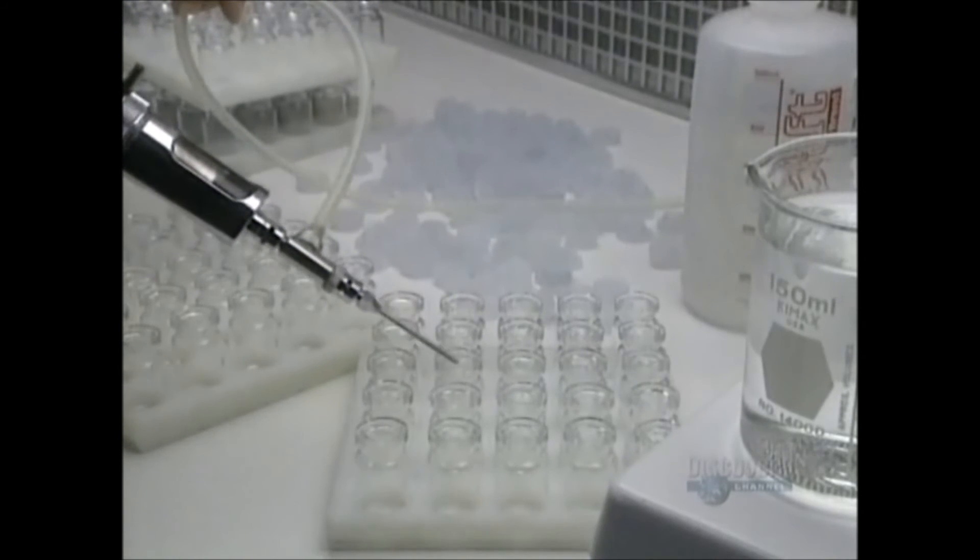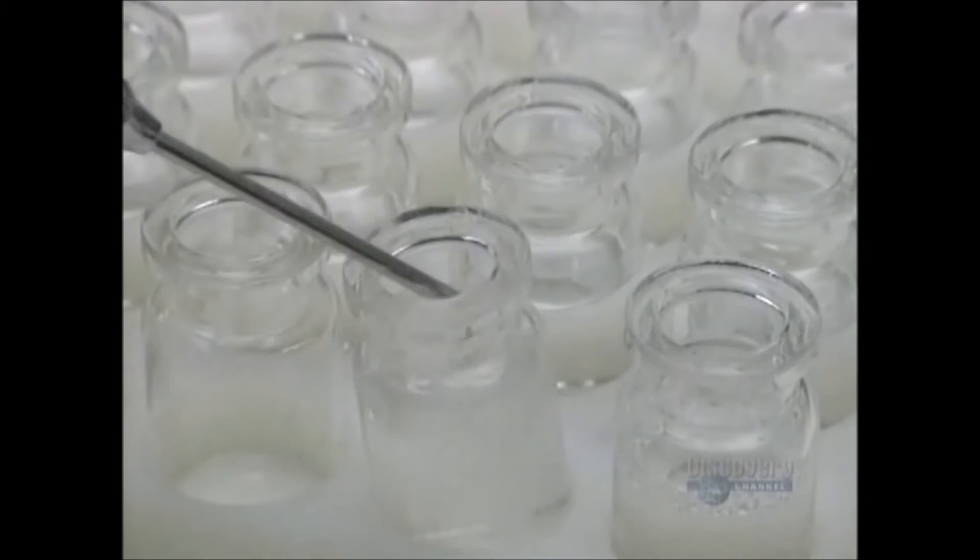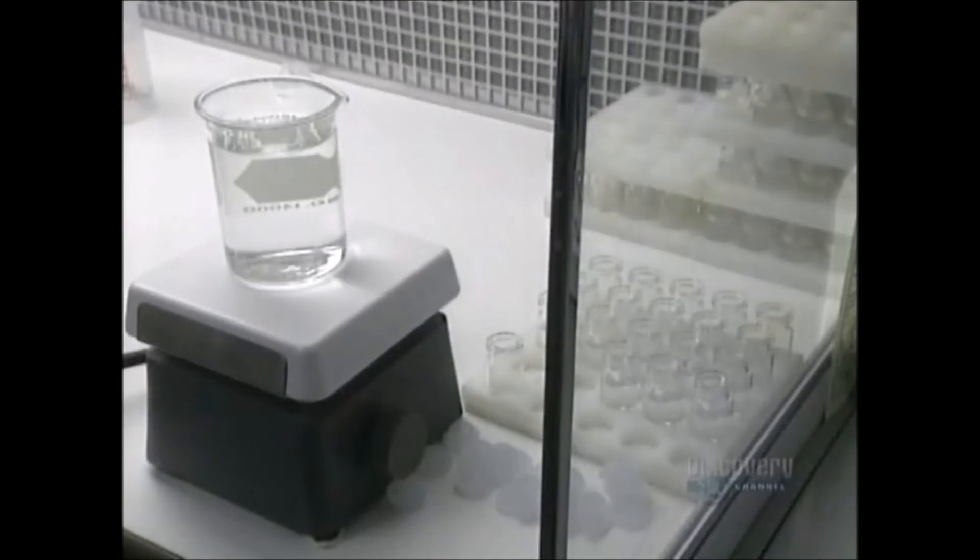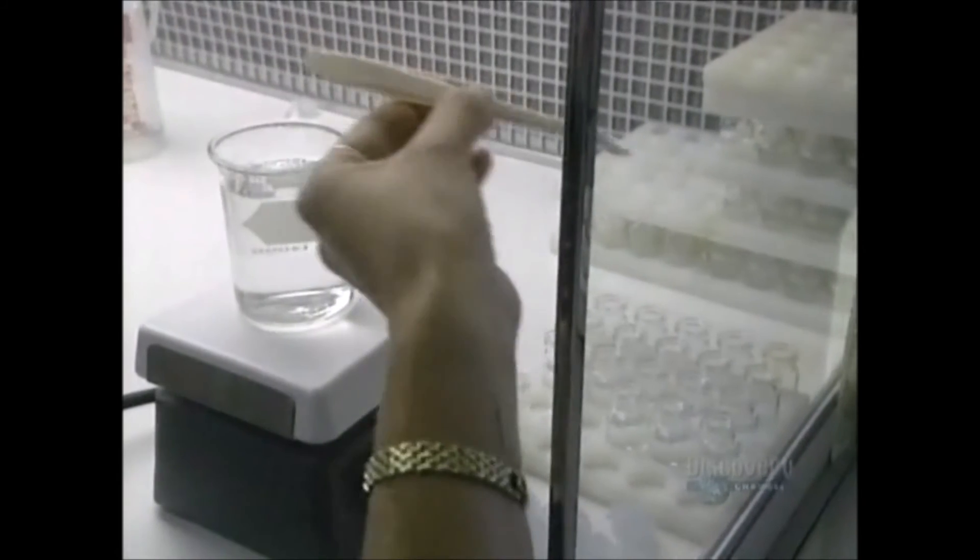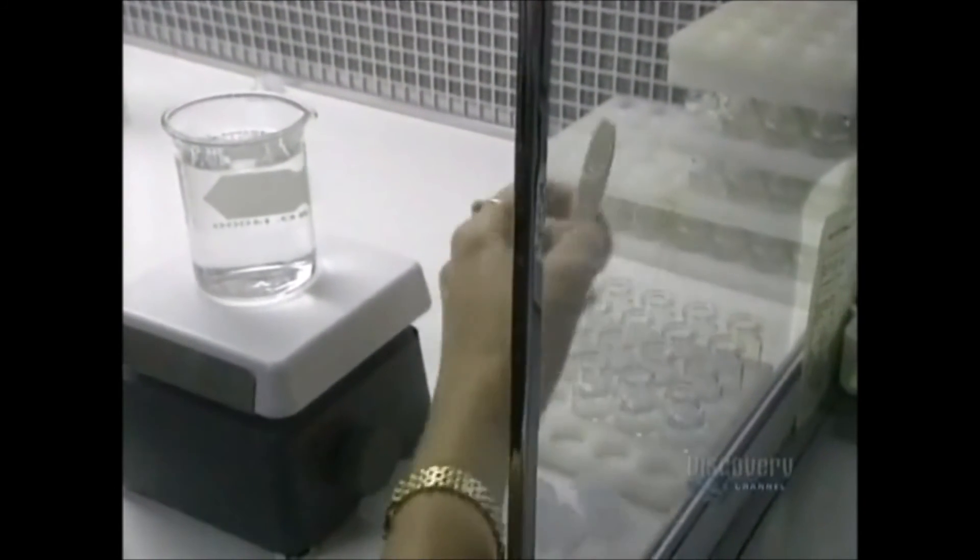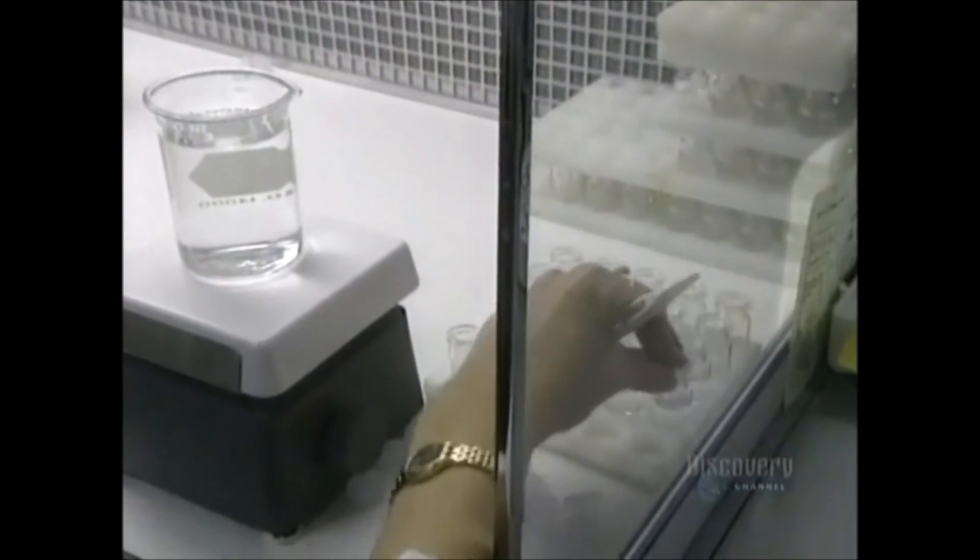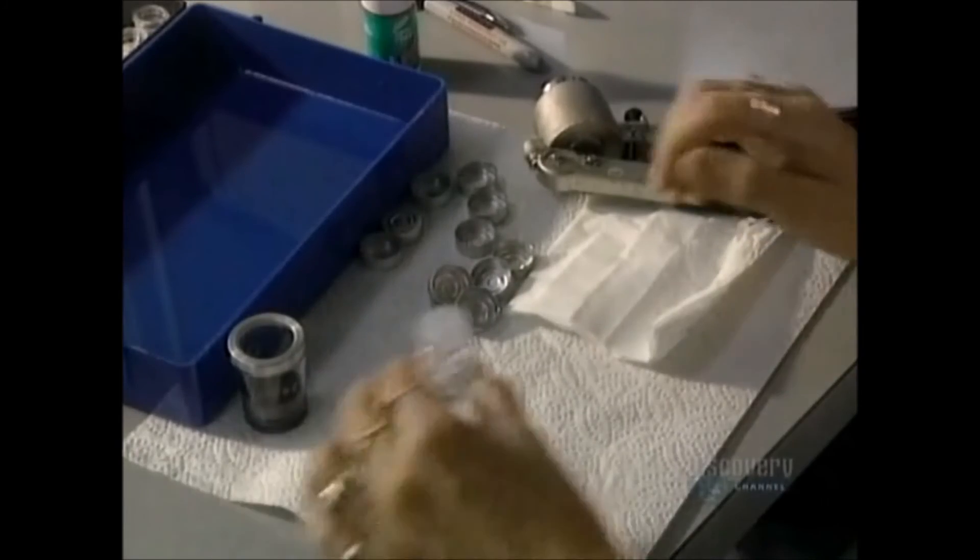The lenses are now completed and are cleaned, and they're stored in containers filled with a salt solution. This little vial that we find at the optometrist is perfectly sealed with a silicone cap and another of aluminum.